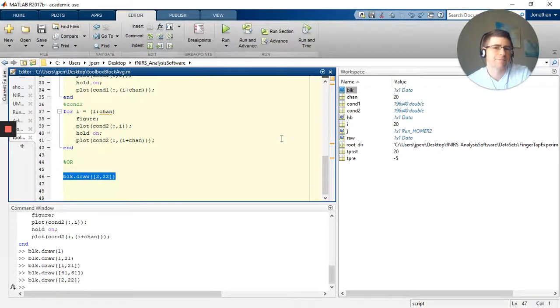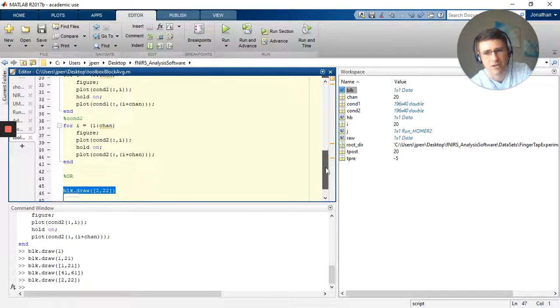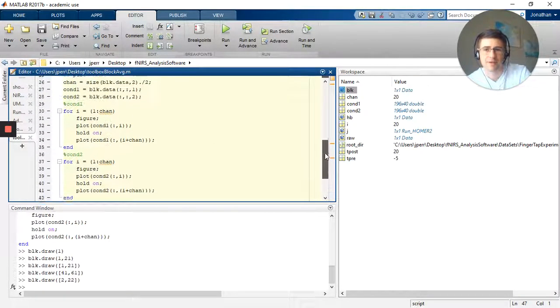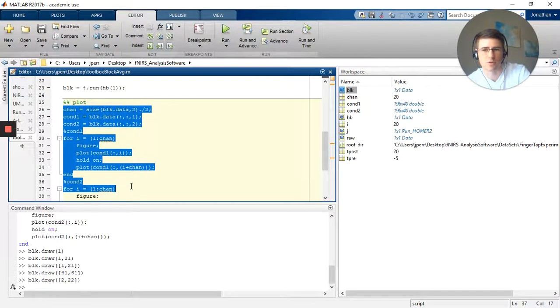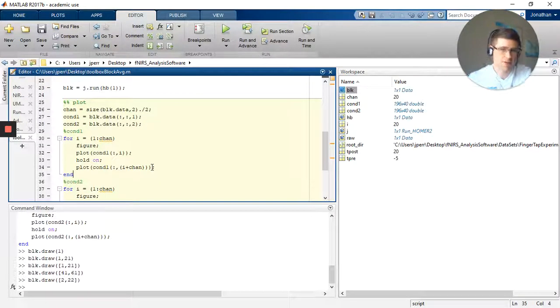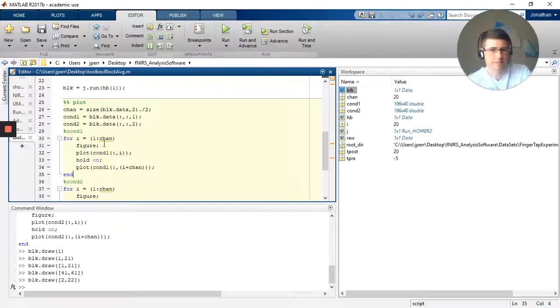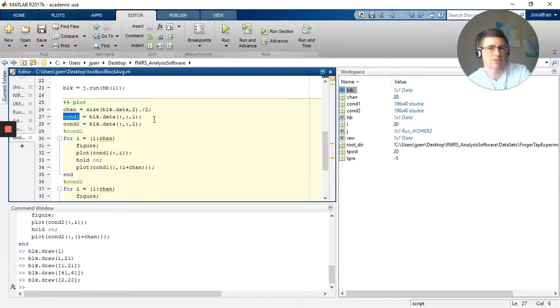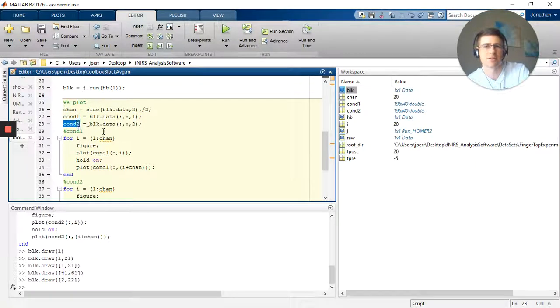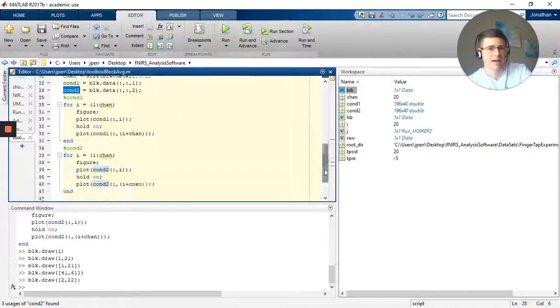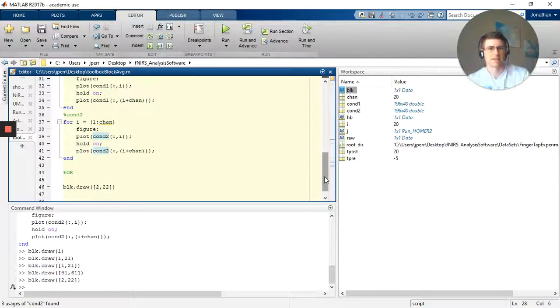But this is how you'd run a block average through this. Personally, for the sake of the video, I think these for loops are very useful. You can pause the screen, read through the code, and see if it makes sense. Nothing very complex on there. You select condition one because you know it's the first third dimension, condition two because you know it's the second third dimension. You figure out how many channels you have and you pair off the oxy and deoxy based on the separation of the channel count.